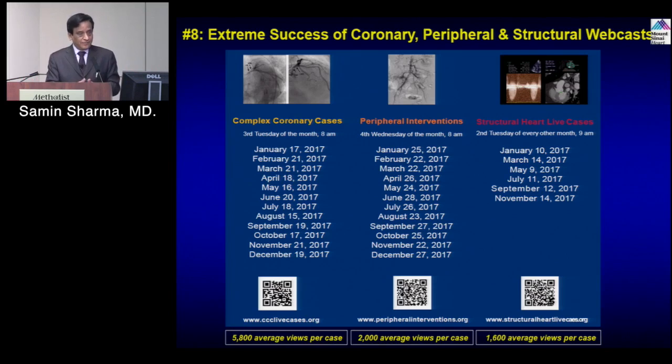Lower CK release, that we actually published back in 2002, when initially we changed from 180,000 to 150,000. So it's more of a personal and anecdotal experience. But I still believe that one of the important Achilles heels of rotational atherectomy, the restenosis, is purely driven by the heat generation.